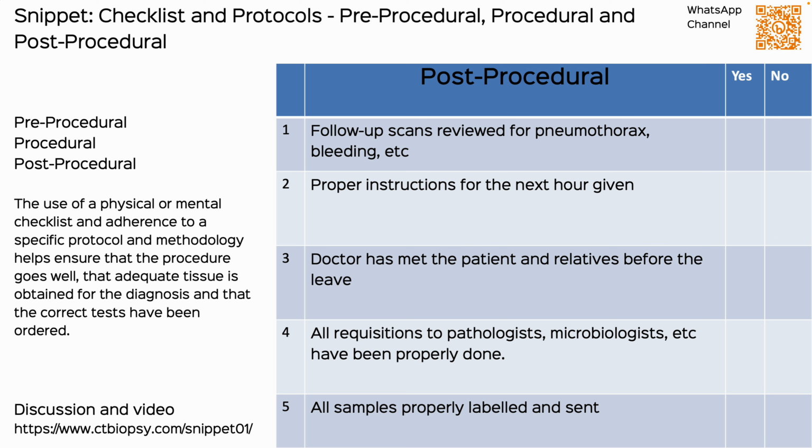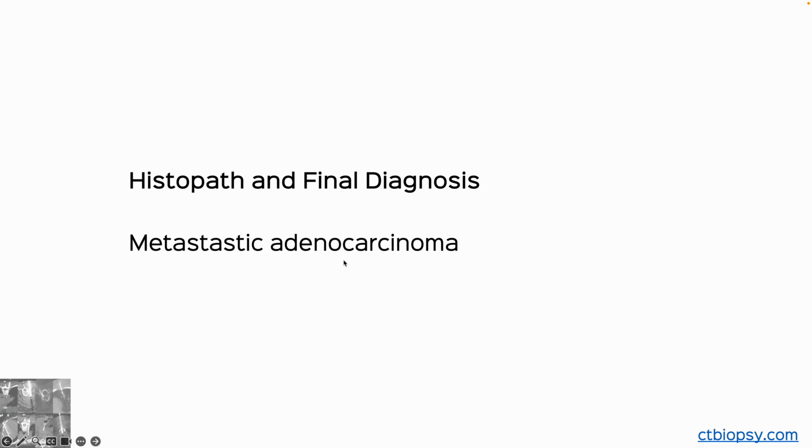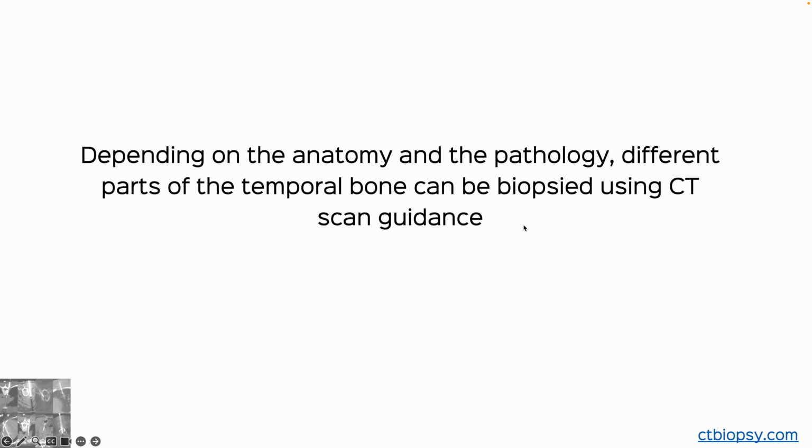Post procedure, there was no problem. The patient waited for an hour and then went home. The working diagnosis was maybe osteomyelitis, or maybe anything else, and it turned out to be metastatic adenocarcinoma. It took about 12 minutes to do in the supine position, and we gave conscious sedation. So this is basically the summary of the entire process.